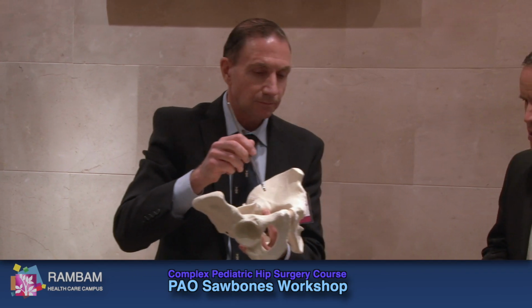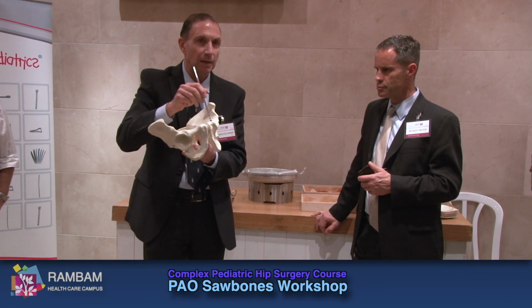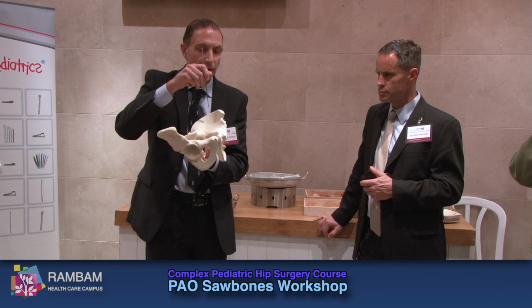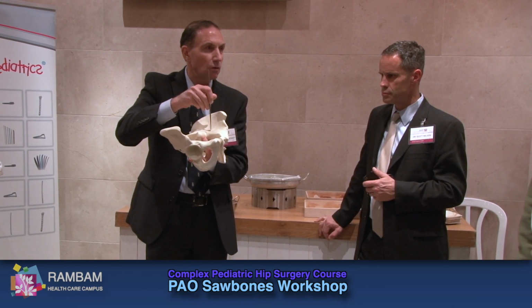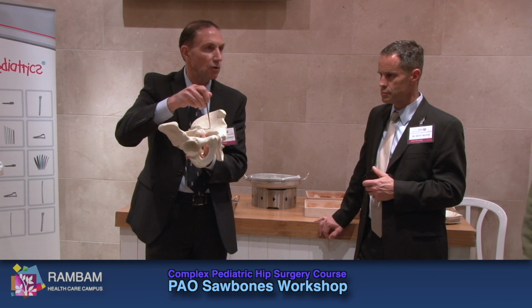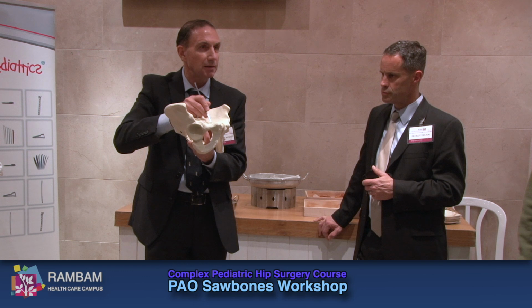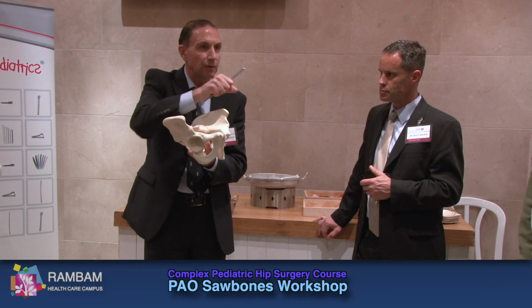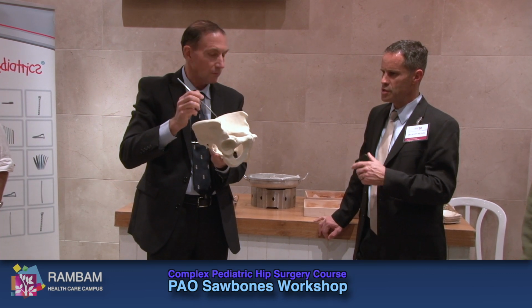Yeah, really well said. So you try those cuts, pubic cut, medial to the eminence, ischial cut, partial cut, heading up towards the lesser spine, and then these 3 cuts straight down towards your angle cut, 1 centimeter from the brim, turn 120 degrees, single cut down the cortex towards the quadrilateral plate, and then connect up those 2 osteotomies. Schanz screw in, and then you need to play with it to do your correction. Which cuts do you like to use a saw for versus an osteotome?